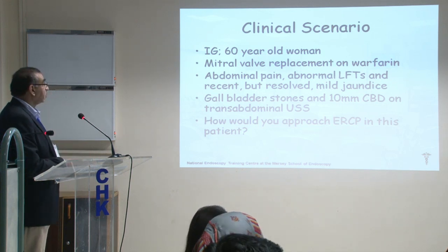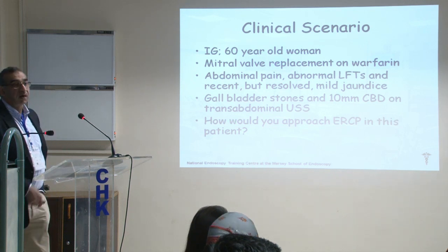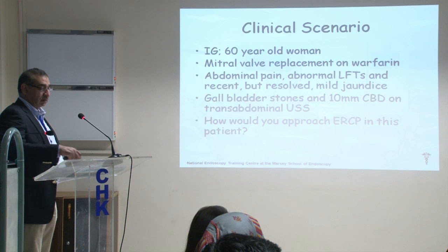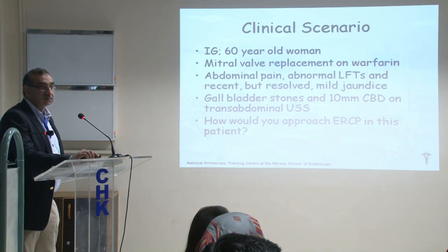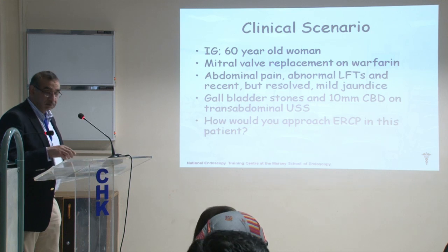Let me change the scenario a little bit, Waqar. This patient needs urgent ERCP because there is a stone impacted at the distal end. This has got acute pancreatitis. Right. Okay. Fine. How would you do that? Warfarin is there. Now what are we going to do? That's a very common scenario. It is. You don't have 5 days for preparation. That's what I'm saying.